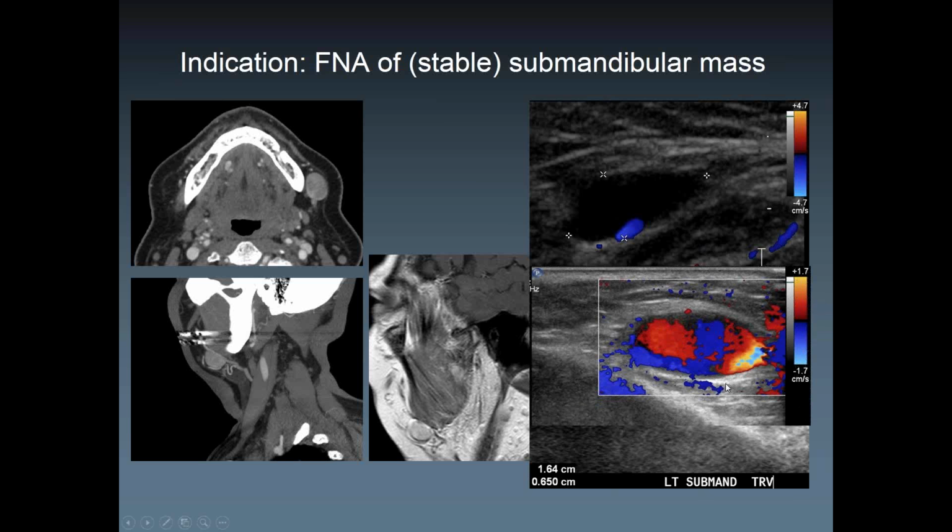So putting color on with a lower scale now showed us some surprise, right? Now the scale is really, really low, just 1, even low already. And now you do see a lot of flow. And that's not only artifacts, because yes, the straight line could be an artifact, but this one here is no longer an artifact. There's actually a kind of swirl within that lesion.